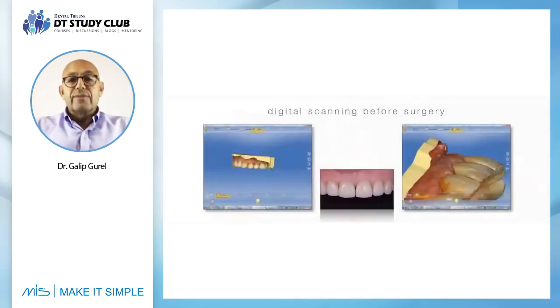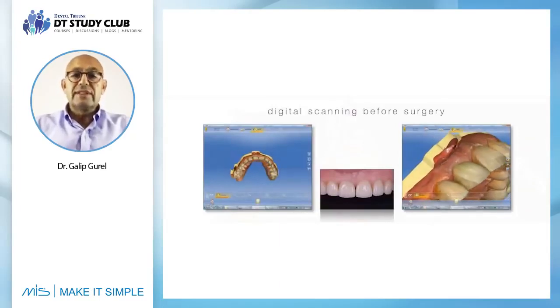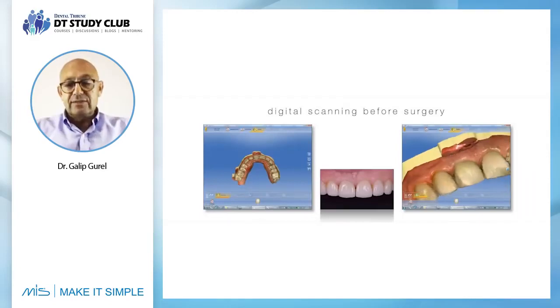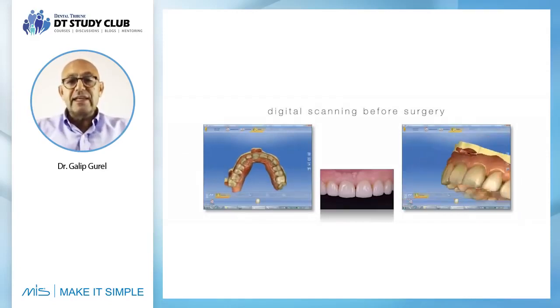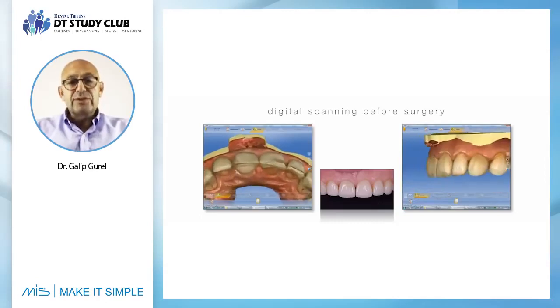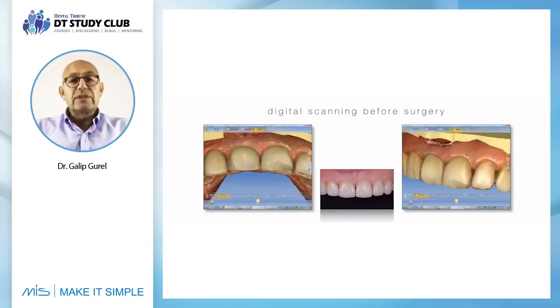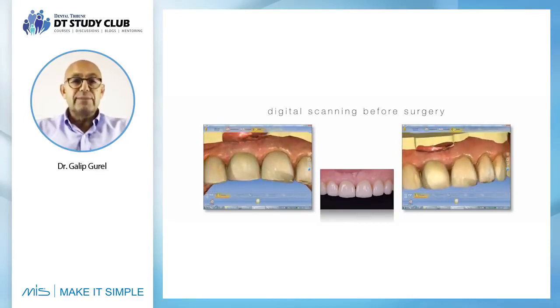Therefore, to start treating the case, first we digitally scan the case. The reason was at least to take the biocopy of the central if we want to redo it over the placed implant.